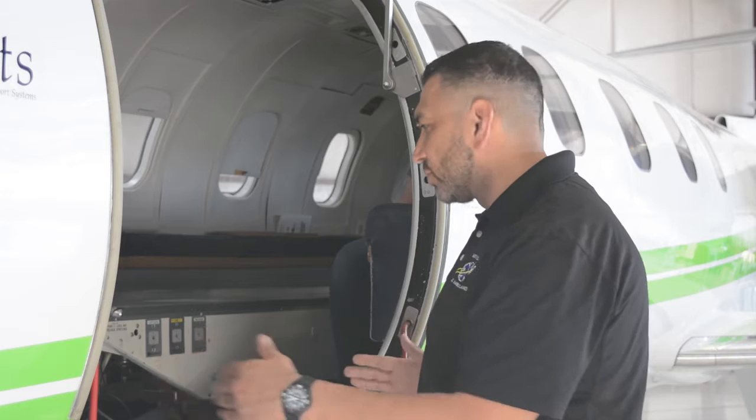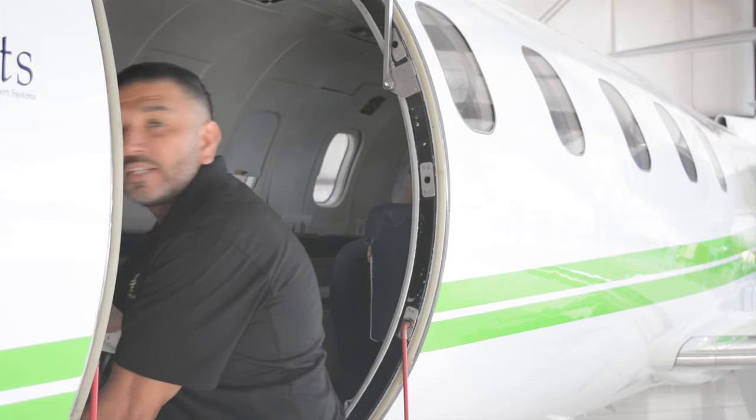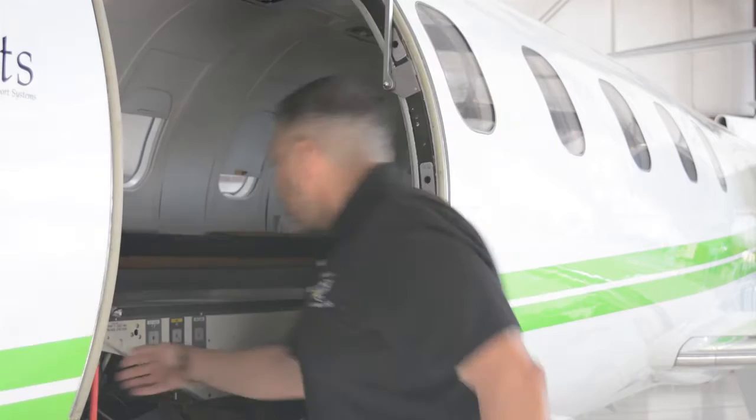Again, in the prior videos, we talked about the door and making sure that we have our rods in place. I'm also going to take this chair, the airway chair, and take the pad off of it. This is going to give us a little bit of room as far as moving the sled onto the gurney, and I'm just going to leave this to the side here. This plate is going to be set down so that we can actually slide everything on. So this is getting everything ready as far as our setup for loading.